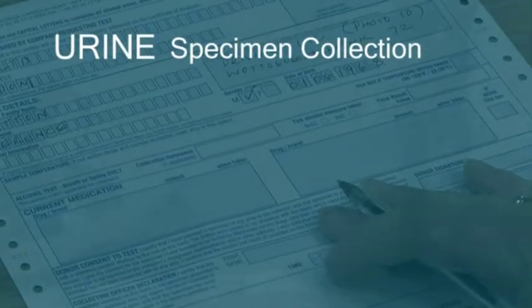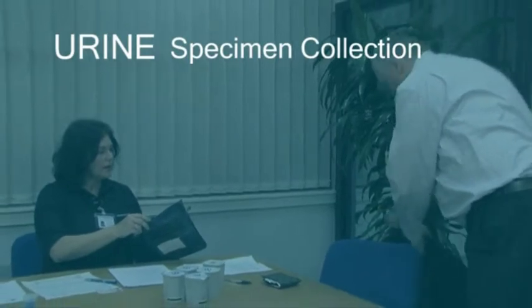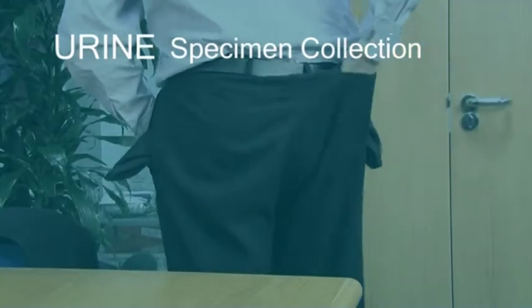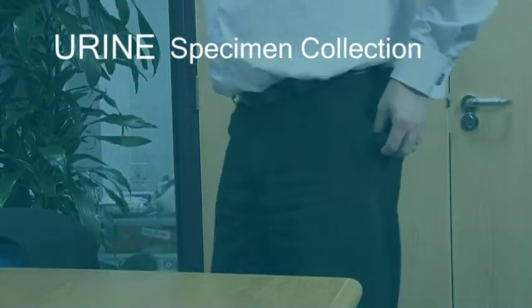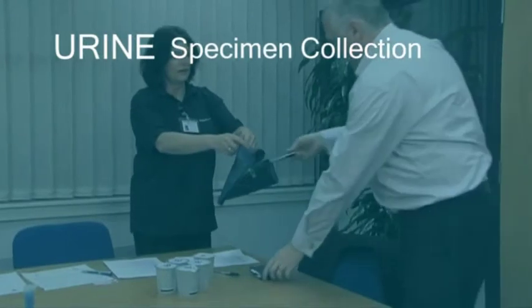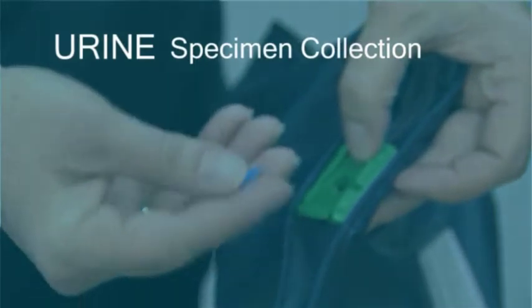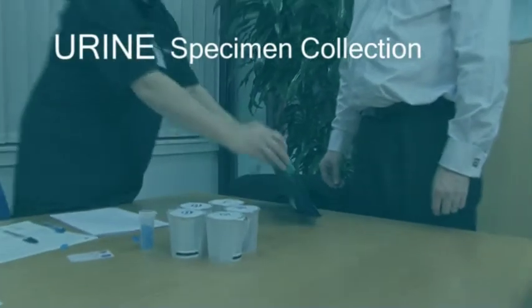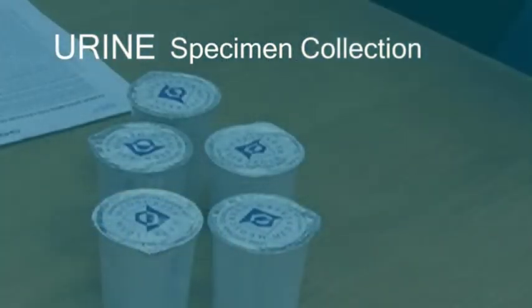Then ask the donor to remove all outer clothing. The pockets of remaining clothing must be emptied and turned inside out to demonstrate that no possible adulterants are hidden. All personal items, which may include money and personal documentation, should be placed in the security bag and a seal added in full view of the donor. Invite the donor to take the sealed bag into the collection area with them.